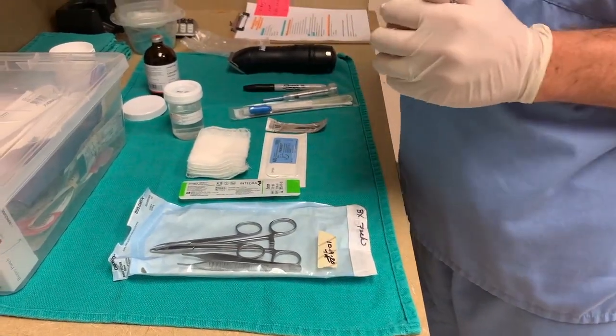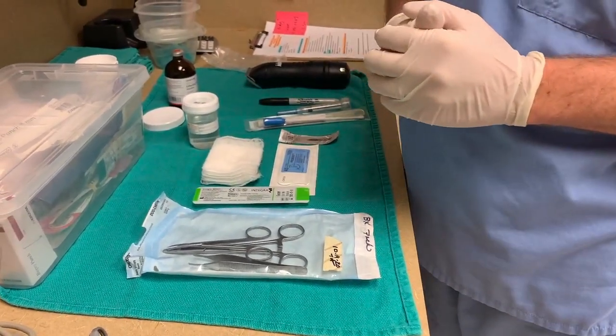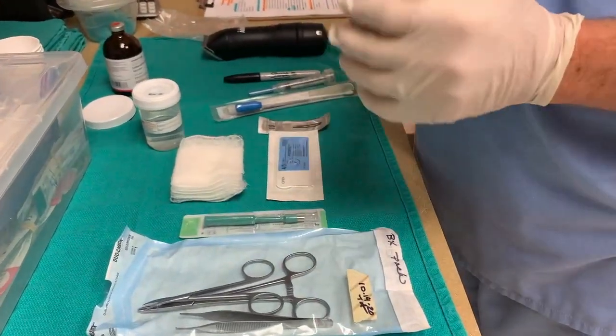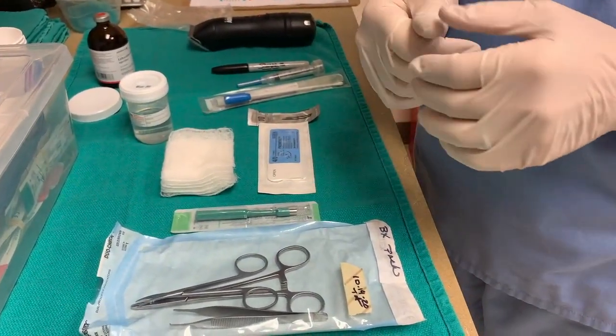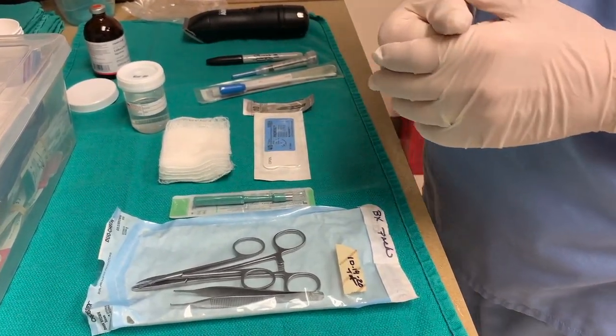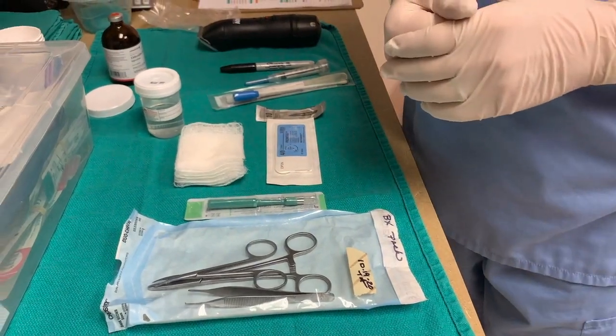We're going to go over how to take a skin biopsy with a biopsy punch, and also included in this will be how to use the first biopsy for a tissue culture if we so desire.